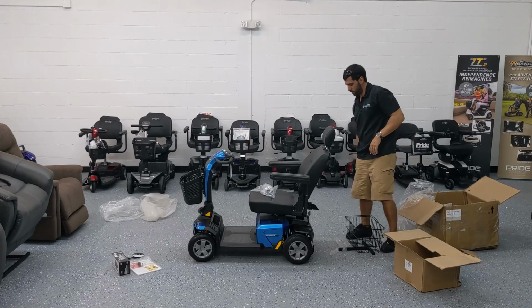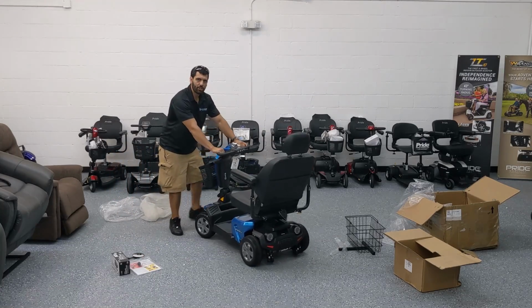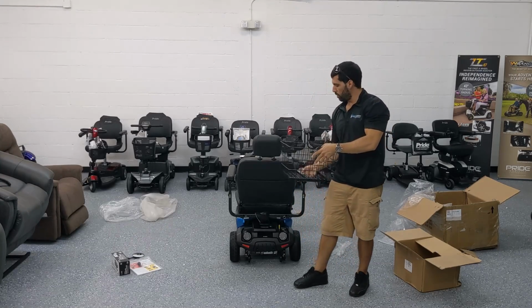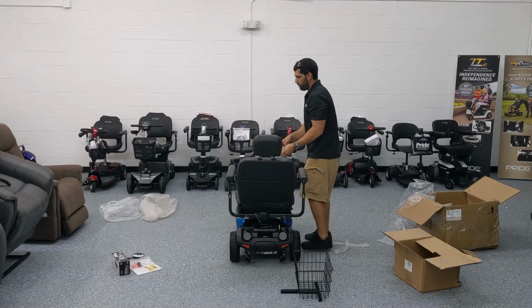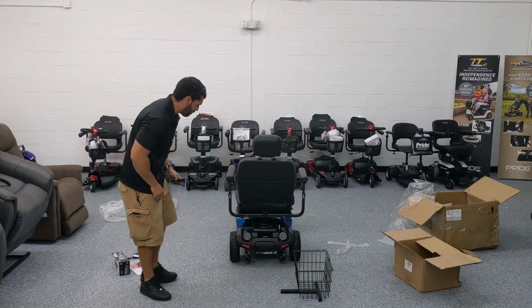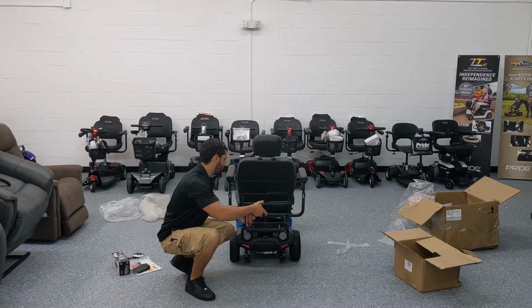In the back of the scooter, just like a vehicle would have a hitch receiving port to attach a trailer to, you actually have an accessory port to attach accessories to. So this rail with the different slots in it allows you to control how far in or how far back you want the basket to be. Inside of your scooter's hitch receiving port, you'll find there's the pin and the tension adjustment, or the adjustment knob here, just like on the armrest. So you take off that leather cover that's on the receiving port, grab the basket, line it up, loosen the knob until it slides in.